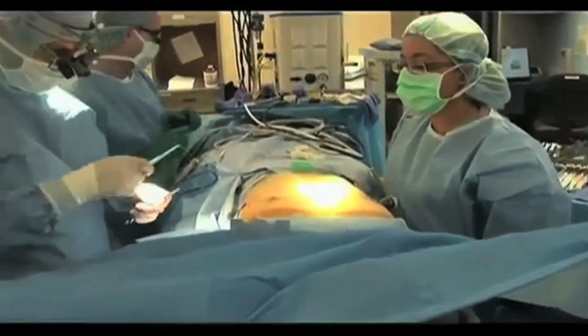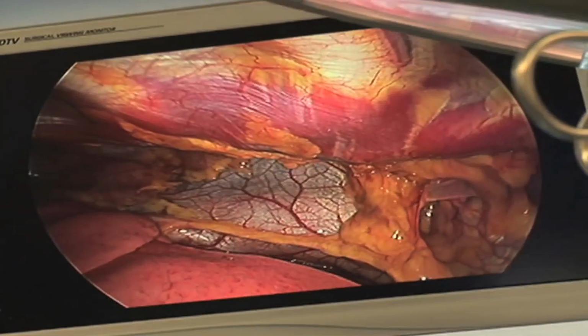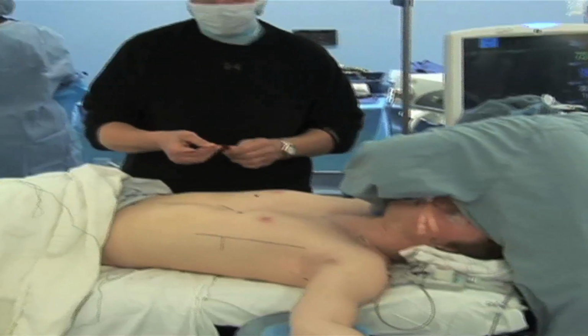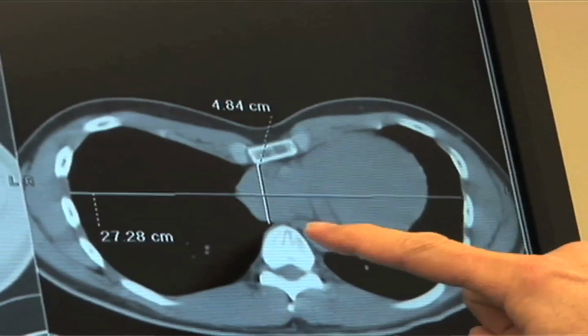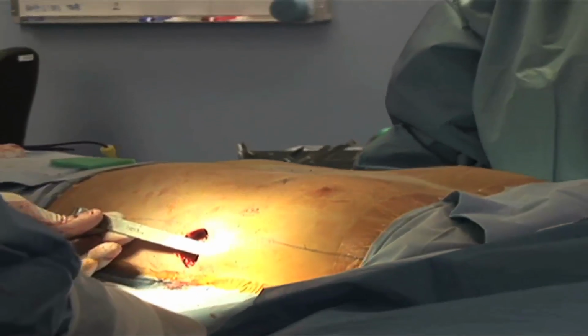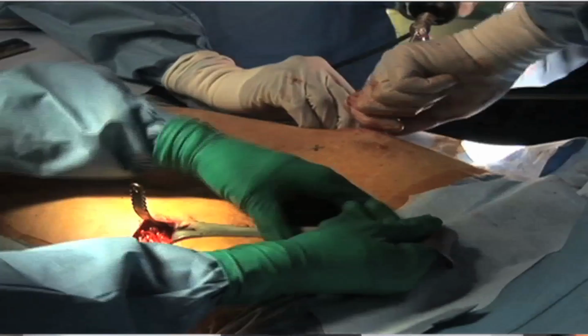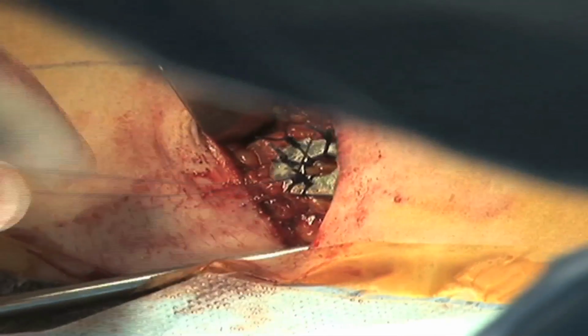It's a minimally invasive surgical procedure. It's done under general anesthesia in an operating room. It involves using a telescope in the chest to visualize the deformity relative to the heart. It requires a skilled surgeon to bend the bars perfectly to conform to the dimensions of the anterior chest. It then requires forming tunnels both superficial to the skin laterally and beneath the defect and above the heart internally. The bar or bars are placed into those tunnels, flipped into place. The chest then responds immediately and is then placed into a corrected position. Once that corrected position is achieved, the bars are secured laterally by suturing the bar into the lateral chest wall.